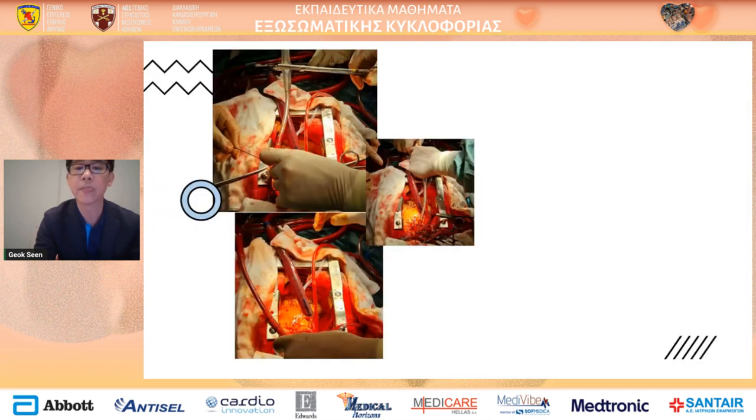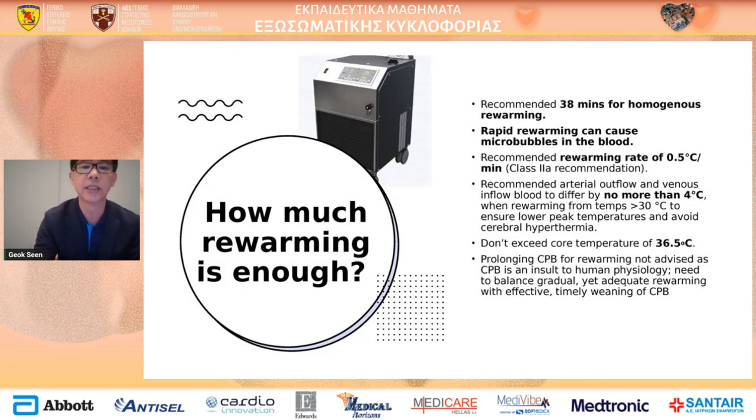particulate to the brain. And this is how we are moving into a sidearm. Okay. Can you see? We have this connected to the sidearm, and then we slowly release the clamp, we fill up the air. Once the air is ready, we clamp the proximal part of the graft, and then we release the clamp and we start. You can see, then we start to have a 10 minutes reperfusion followed by rewarming.